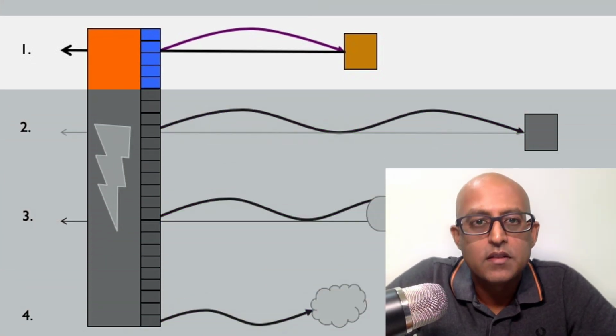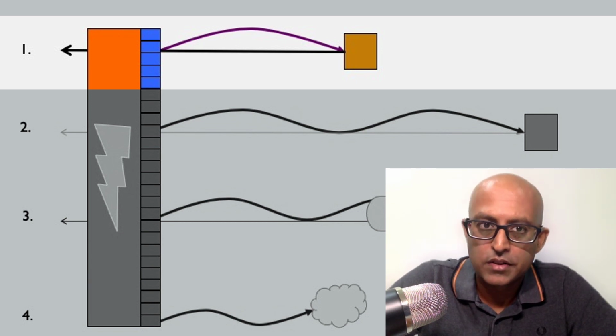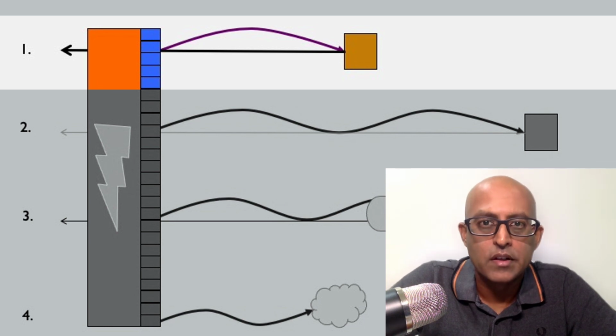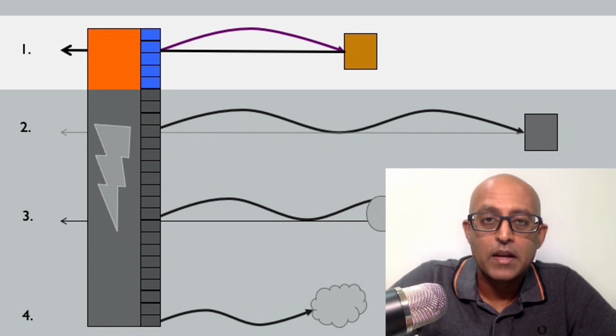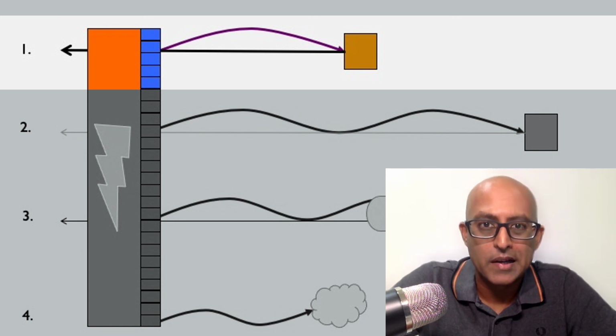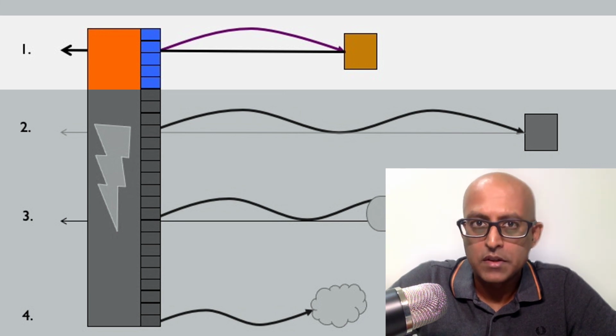So let's take this situation. Let's say, for argument's sake, we have a hard structure within the tissue that we're examining. When ultrasound waves come and strike on it, it's going to get reflected back. And because it's a hard surface, there's going to be more sound waves bouncing back. As a consequence, it's going to appear bright on our image.